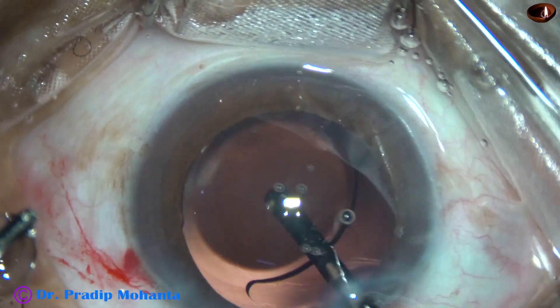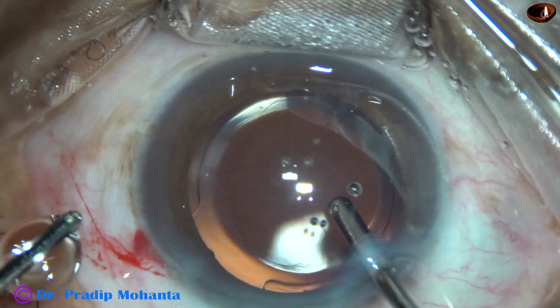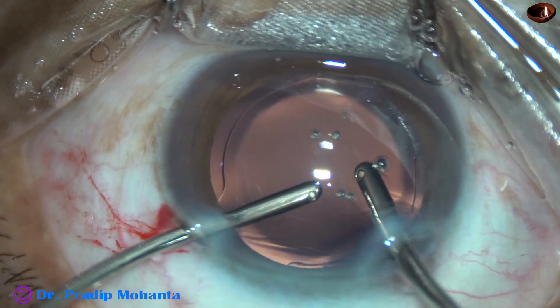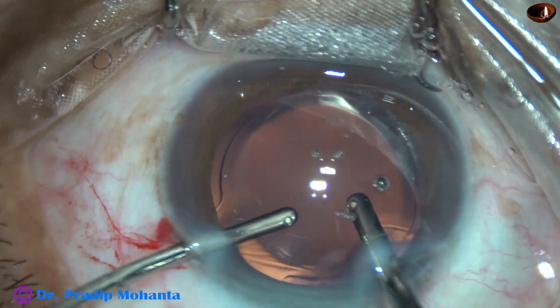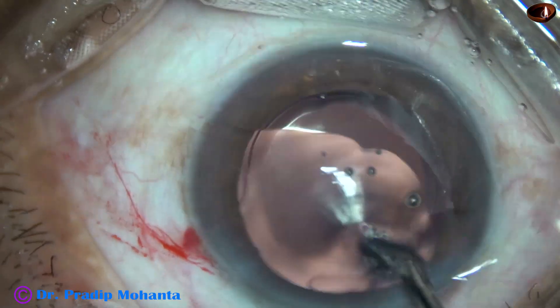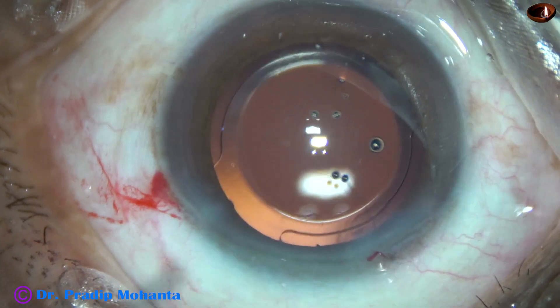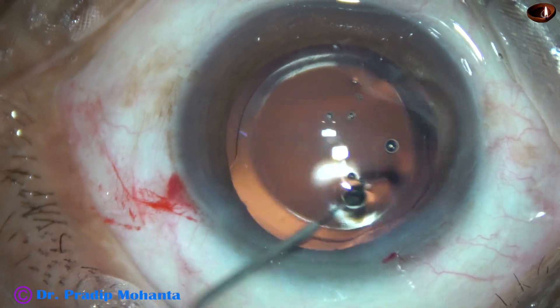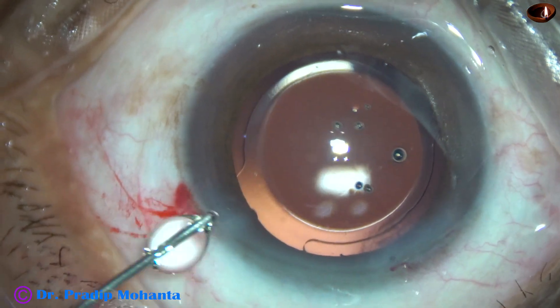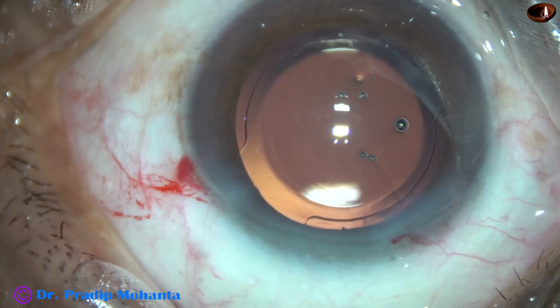It is nicely done. The anterior rim of the rexis — that is, the anterior capsular rim — is overlapping the optic of the intraocular lens all around nicely. And this helps in centration of the intraocular lens.